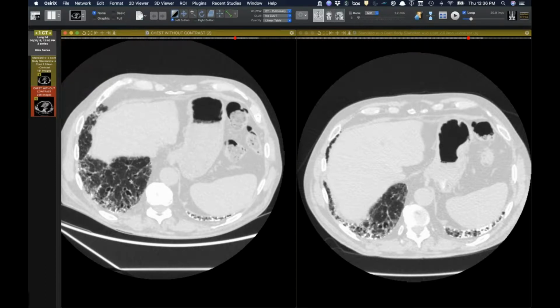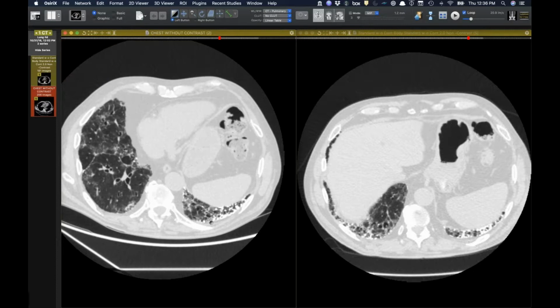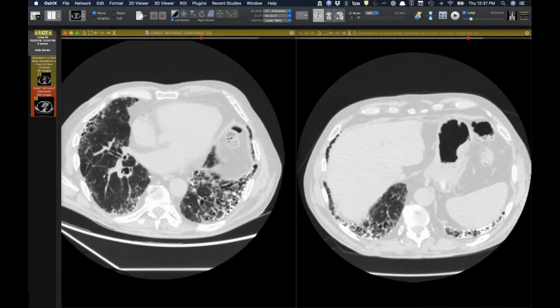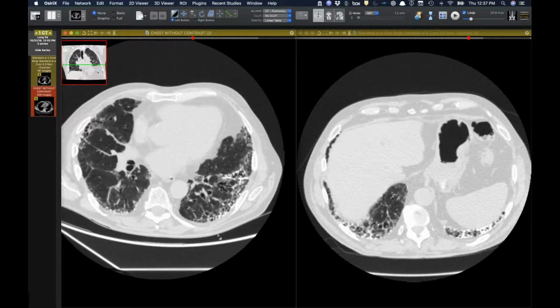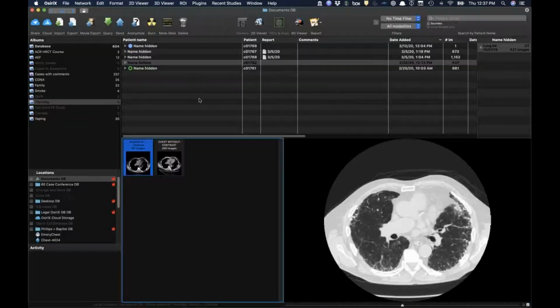And then there was the more recent one that Gruden published, where they looked at dendriform ossification without fibrosis, and a lot of it was aspiration related. I've shown a couple of cases of that, but even if you subtracted the fibrosis, I can't think of a case of amyloid I've seen that had a subpleural distribution like this. I was looking through our teaching files, and a lot of them are more central or diffuse. So I don't know if you have any examples of confirmed amyloid with a similar distribution. I've never seen that. No, that's just food for thought.